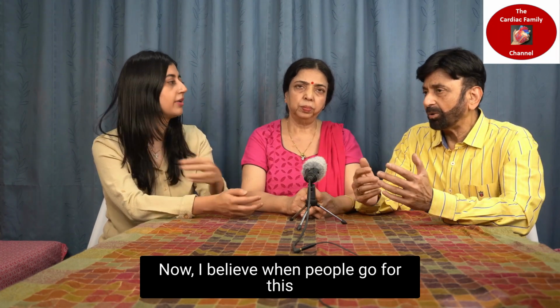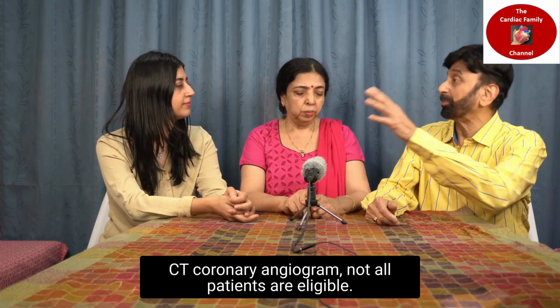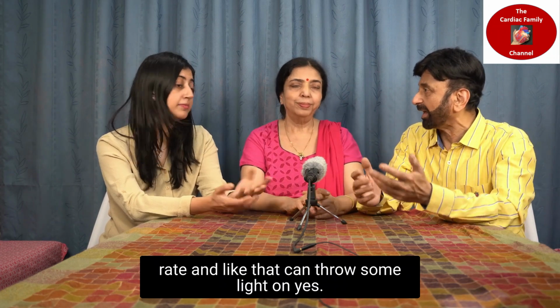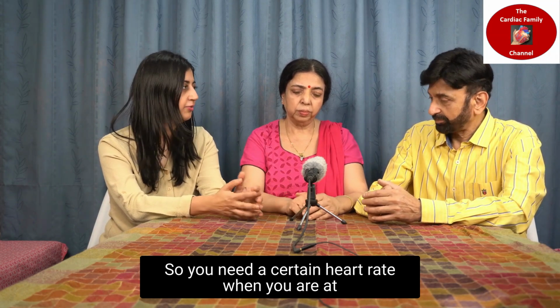Now, I believe when people go for this CT coronary angiogram, not all patients are eligible. Some of them are rejected for some reasons, heart rate and like that. Can you throw some light on that? Yes, so you need a certain heart rate when you are subjected.